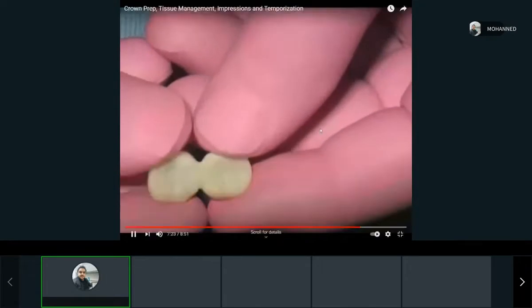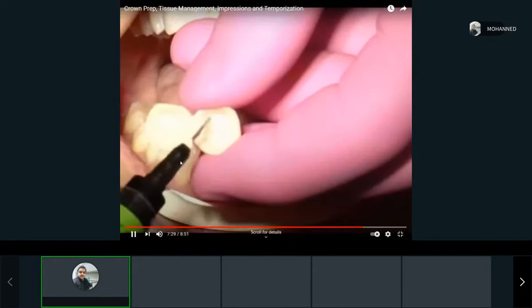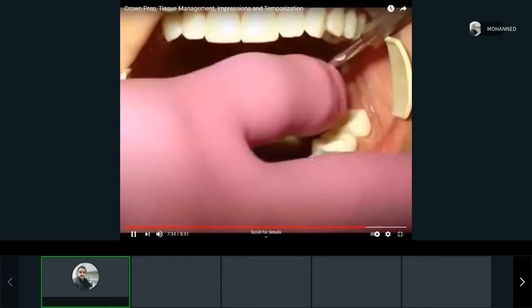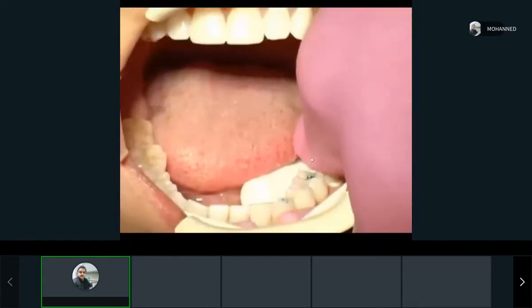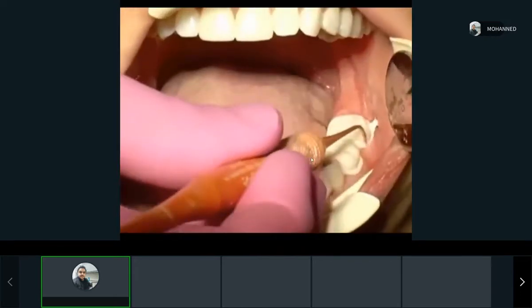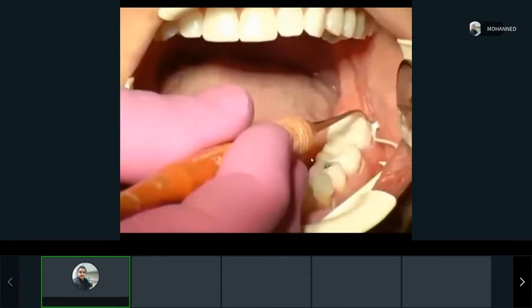And you can see these are their teeth, but again, in a temporary material, we put some glue, which technically, this is most probably flowable composite. And then we're going to place it in there, light cure it for a second. See, as he's holding it, most probably, we're going to cure it. Cure. That's the curing light without any barrier on it. So just a small cure just to get it set at the beginning and then removing the excess glue material technically.